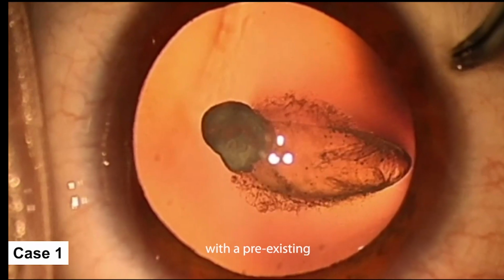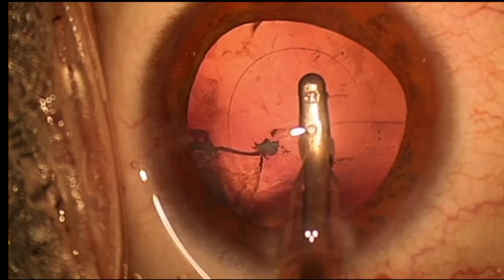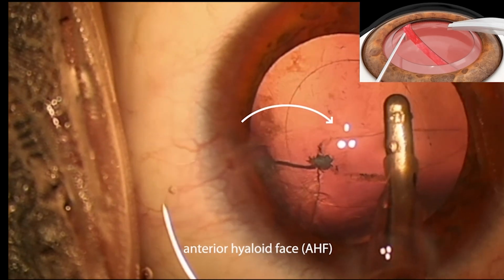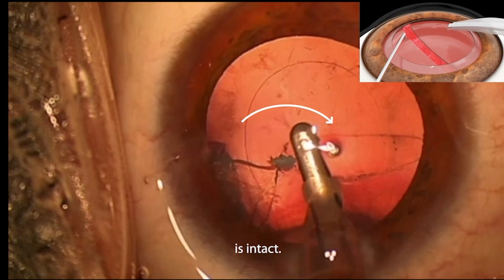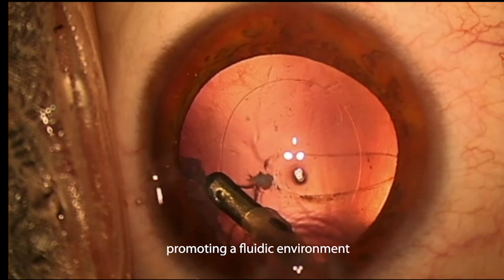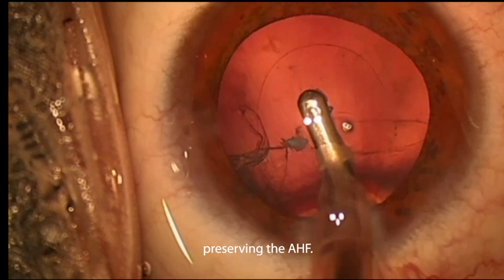In this patient with a pre-existing posterior capsular rupture, the posterior capsular tear edges are fluttering and appear straight. This indicates that the anterior hyaloid face is intact. The intraocular pressure settings are low, promoting a fluidic environment that is favorable for preserving the anterior hyaloid face.